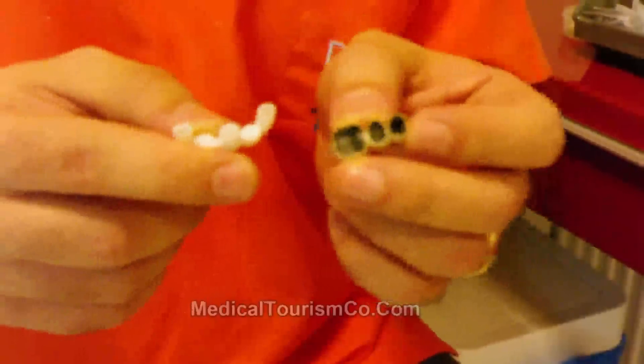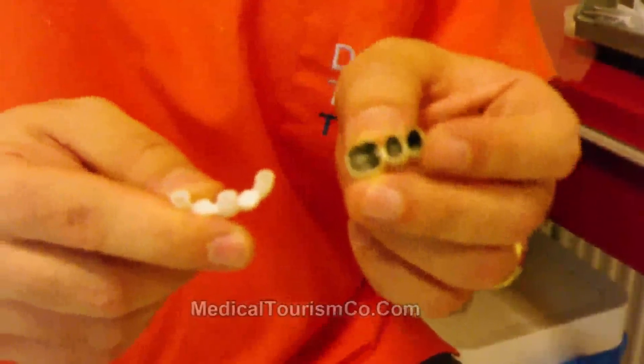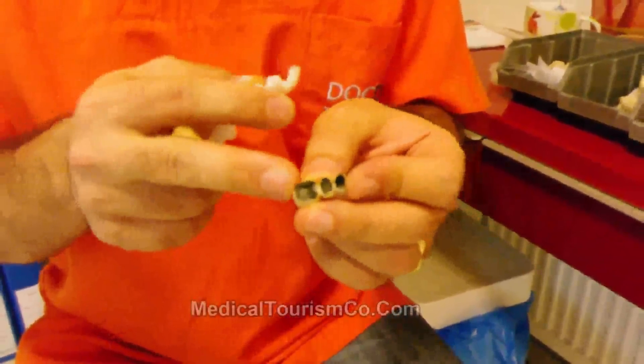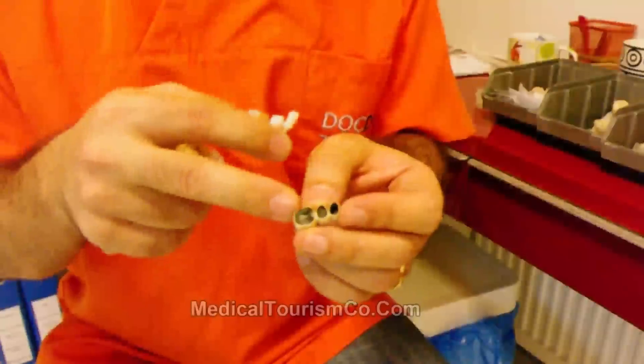This is the big difference in precision between zirconia and metallic works. The second difference is that zirconia is biocompatible, whereas metallic works are ion-releasing materials.